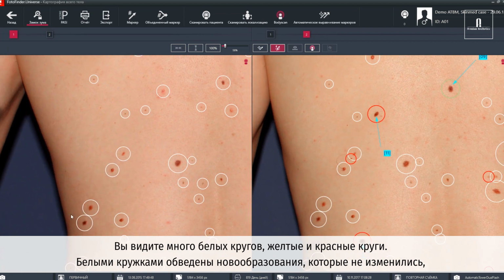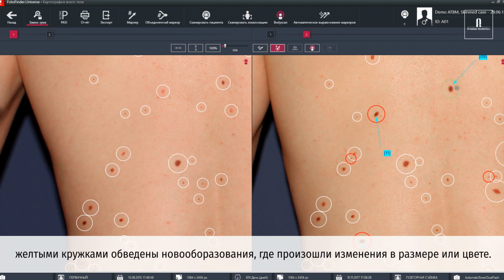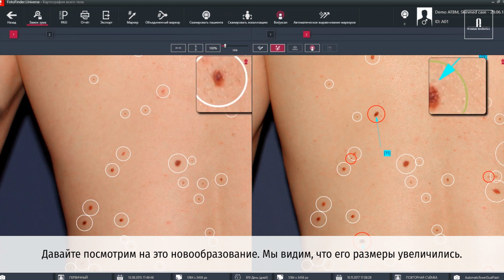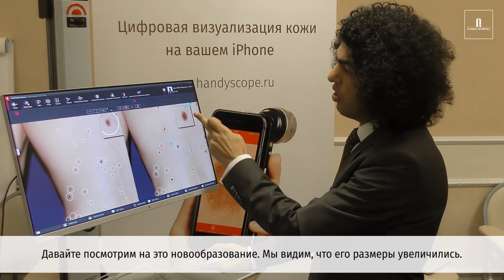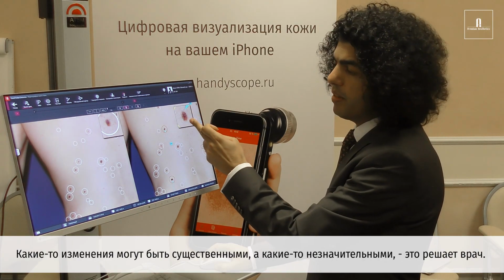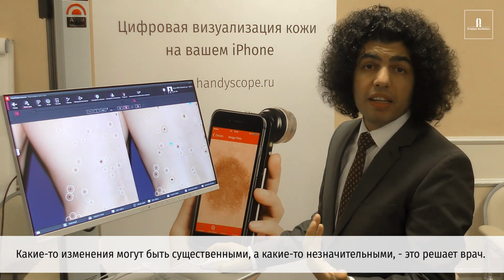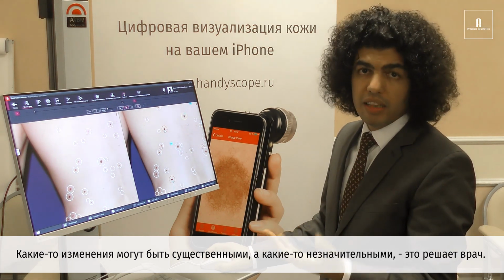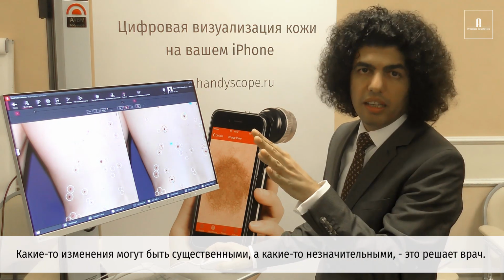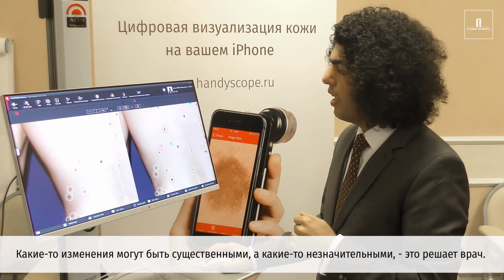White circles are lesions that didn't change throughout the time. Yellow circles mean there is a change, maybe in size. Let's have a look at this lesion, in fact, and we realize that this lesion changed, it grew. It was there at this size and then it grew in size. Some changes might be relevant, some changes might not be relevant, okay? This is something that the doctor decides at the end in his diagnosis. We just highlight whatever is new or changed.